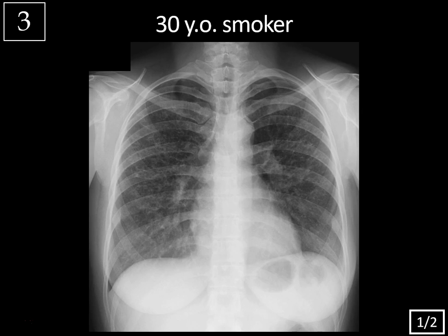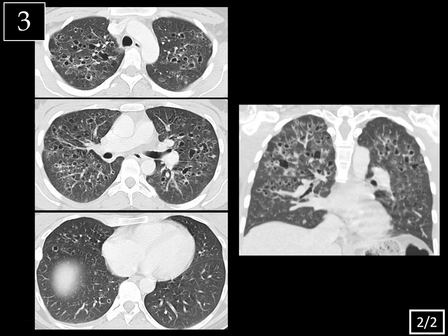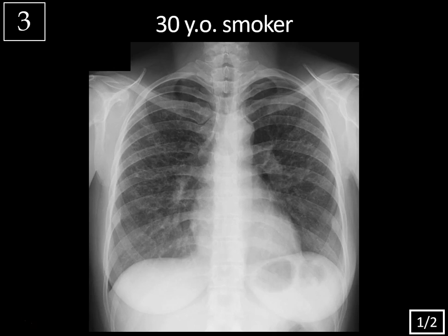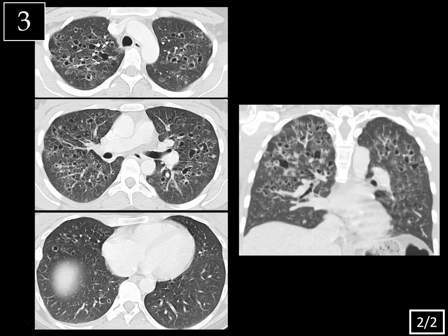Next case: this is a 30-year-old smoker, chest X-ray and CT chest. At first glance you might think this looks just like the chest X-ray for the patient with LAM, but instead of just fine reticular markings, we're seeing a reticular nodular pattern throughout the lungs — notice these little nodules. On the chest CT, we can see that's due to multiple cysts that have a bizarre irregular shape with irregularly thickened walls. Notice how this is different from the patient with LAM.